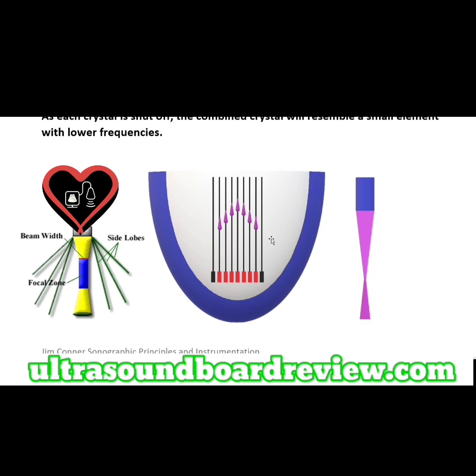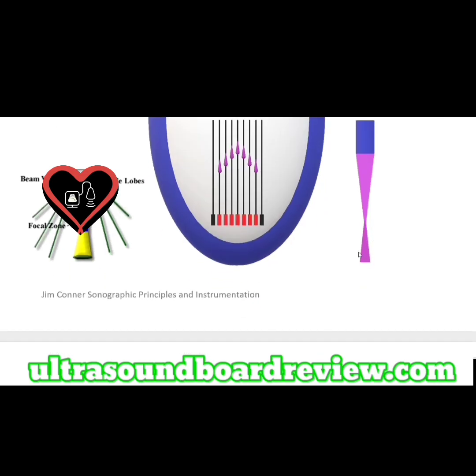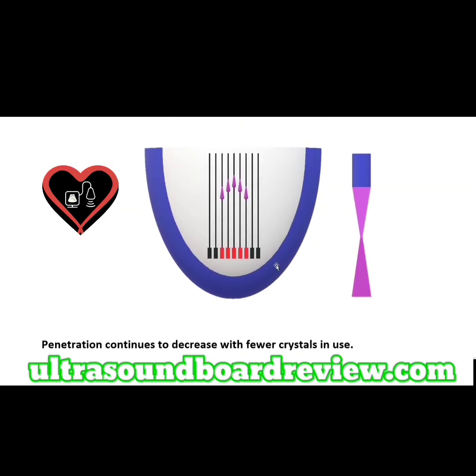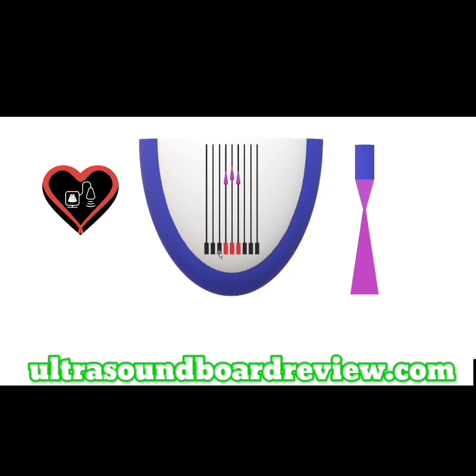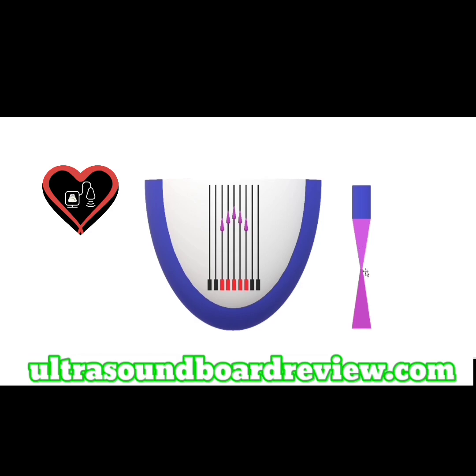Dynamic aperture, the reason why it's so valuable and the reason why it improves lateral resolution is because it's going to change the focus at various depths. So here, if we continue to shut off the outside crystals, our focus is right about the middle here. And then if we again continue to shut off more crystals, and we're left with 3 crystals, we are bringing our focal depth, or we're bringing the focus closer to the transducer. The machine or the transducer is shutting off these crystals so that we can change the focus at different depths. The whole point is to make lateral resolution the best at these different various depths.